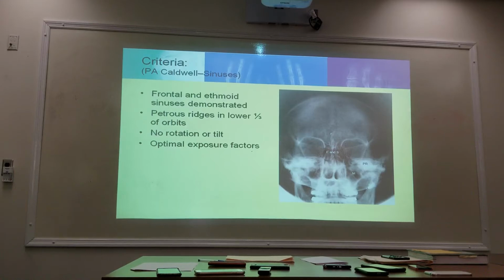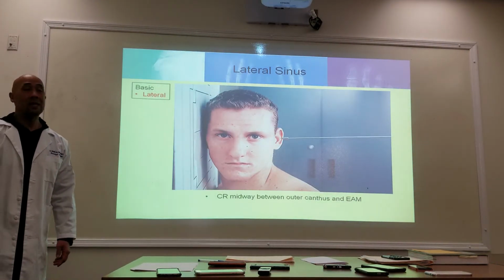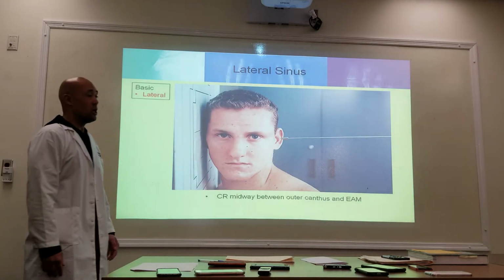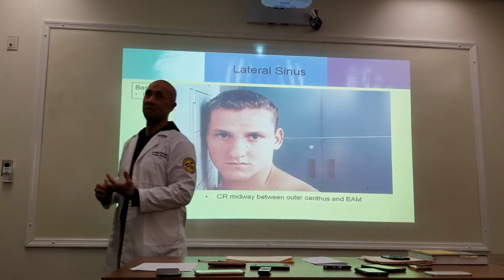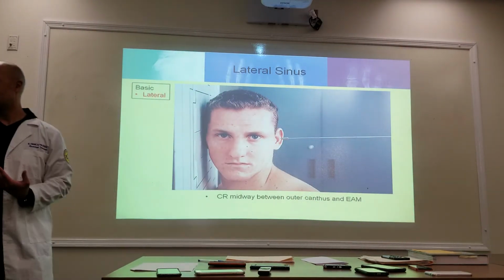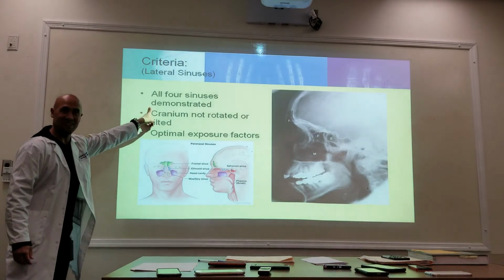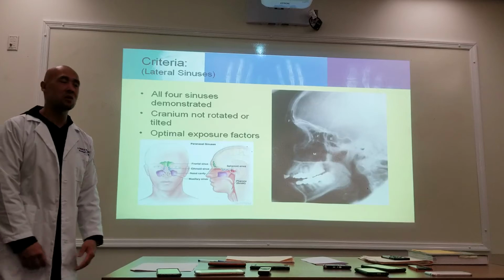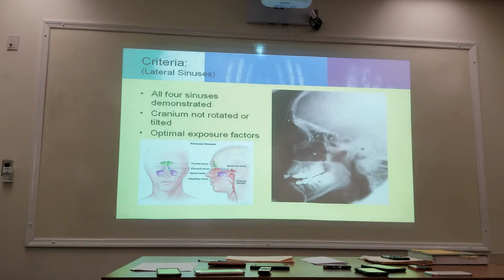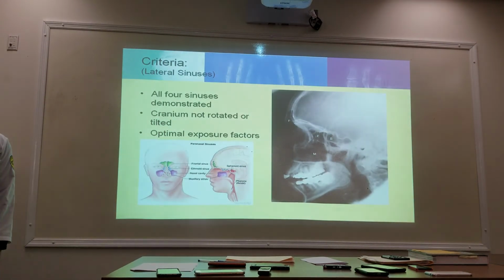Okay. So this is good for evaluating, again, here's a question. Lateral. If I were to ask you which position is good for evaluating all the sinuses, what are you going to tell me? Oh, right here. It says right here, all four sinuses are demonstrated. So this is the projection, the view that demonstrates all the sinuses. So highlight that.